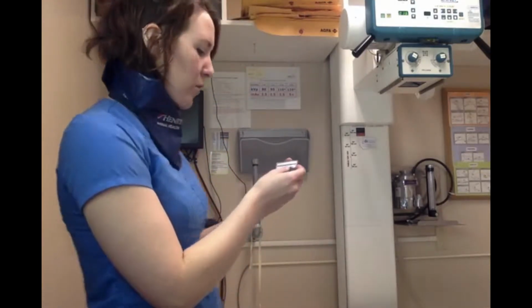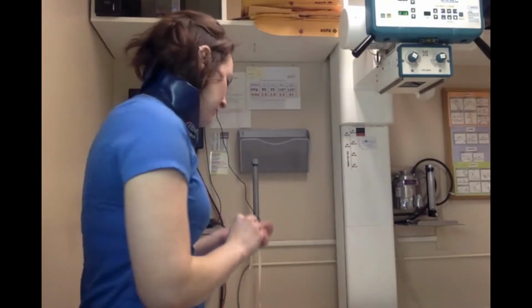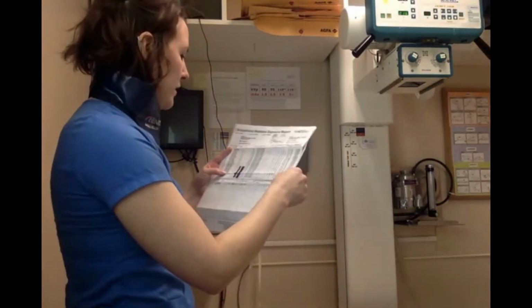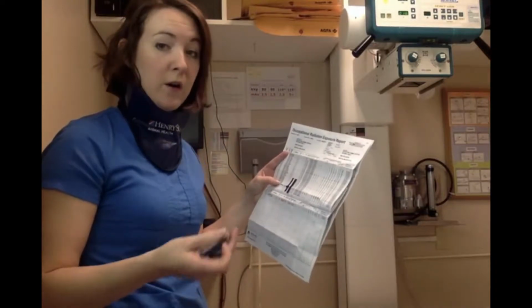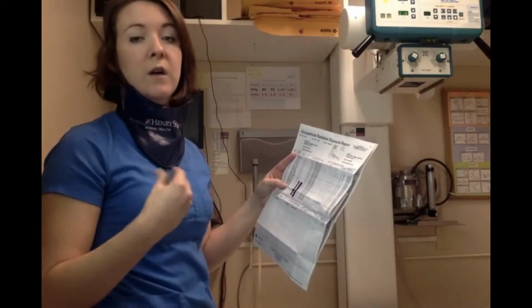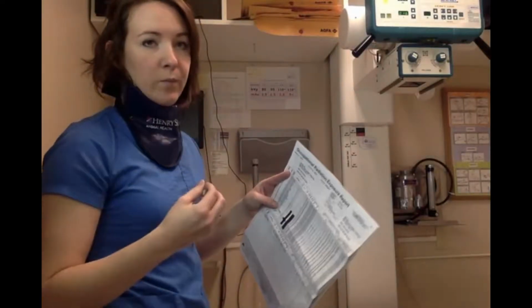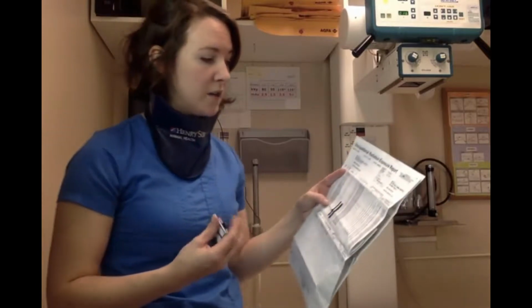And then quarterly, so 4 times a year, our safety officer, David, sends these in, and we send them to an outside company who reads them and sends us a report, and then they let us know how many millirems per year we are being dosed with, so we can make sure we're being safe, there's no faulty equipment, and we're not doing anything stupid to gain any excess doses of radiation.